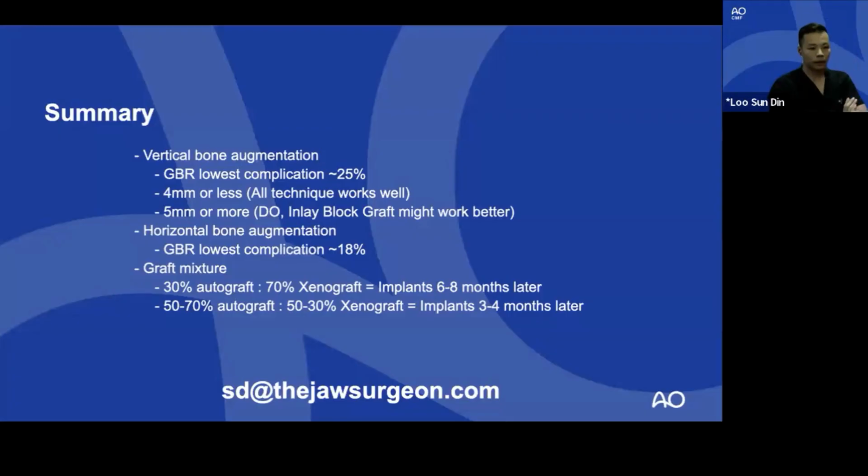Well, occasionally I do encounter the incisive canal where there's inadequate space or bone thickness for an implant to go in without touching it. Then I might have to graft it. And if I have to graft it, I purely use autogenous, because why not? It's so easy to just harvest some from the palate. But then we sacrifice sensation. Yeah.